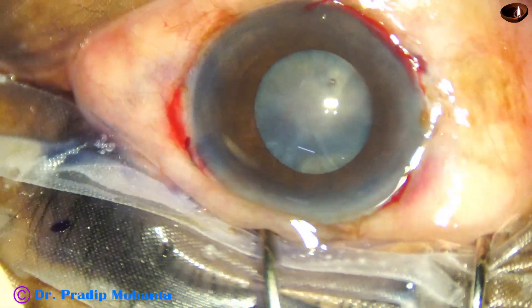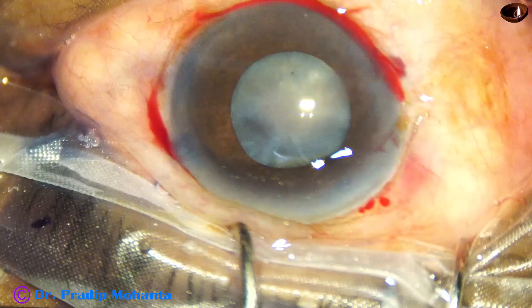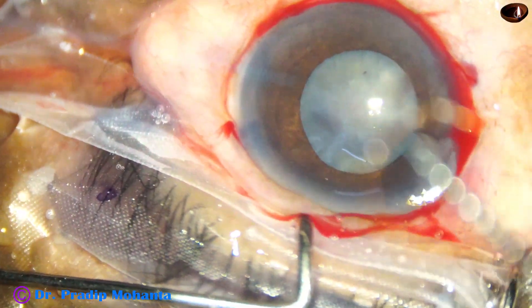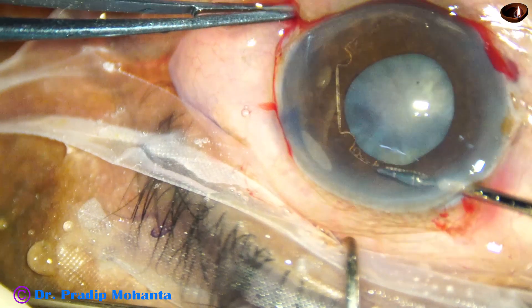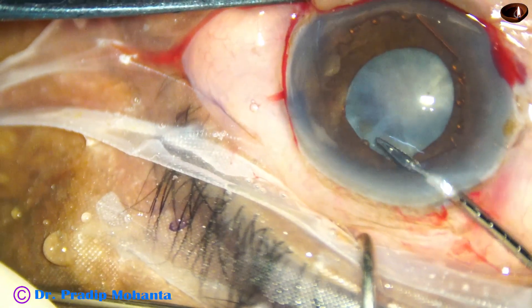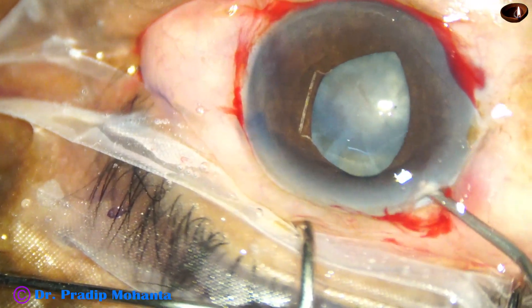By this time the incisions have been made and the anterior capsule has been stained with trypan blue dye, visco injected. This is B-Hex, invented by Dr. Subhan Bhattacharji of Kolkata, India. Here goes the B-Hex — it has got flanges; alternate flanges have three tabs. I hold the middle tab and place these alternate flanges with tabs under the iris. This is a uniplanar device.